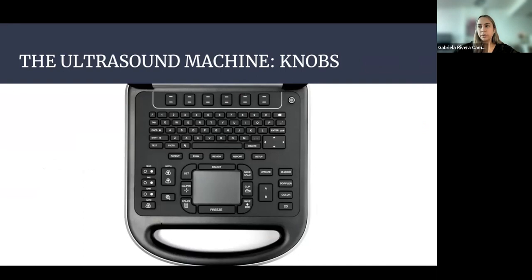Lastly, let's review the buttons, also known as the knobs. First, we're going to turn on the power. Then we need to input the patient's information, such as the name, the date of birth, and the indication for the exam.